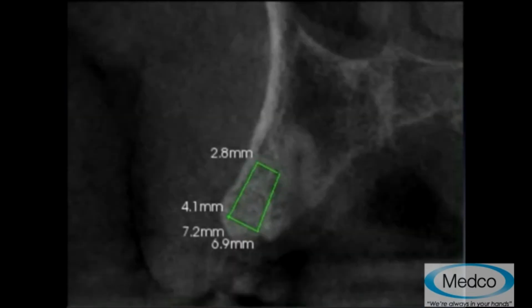Well, at about 3 months, we do some measurements, and unfortunately, he has an impacted permanent canine, which confounds our ability to necessarily place an ideal length implant. We can talk about 10 millimeters, 12, 13, whatever. This is a patient where I need a shorter implant, and I need something objective to tell me when I can provisionalize him, because he's in and out of the country all the time.